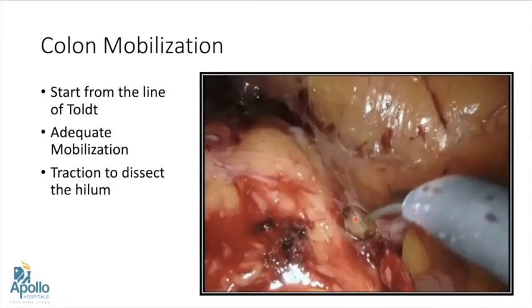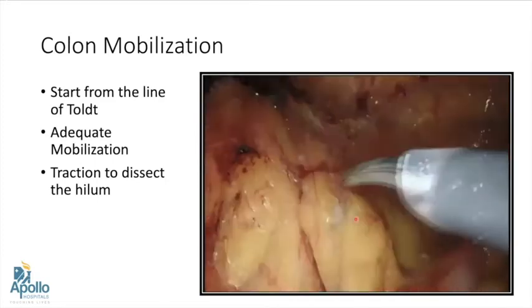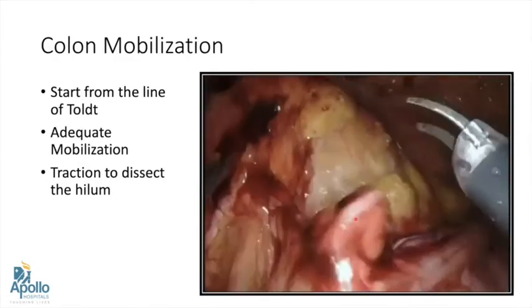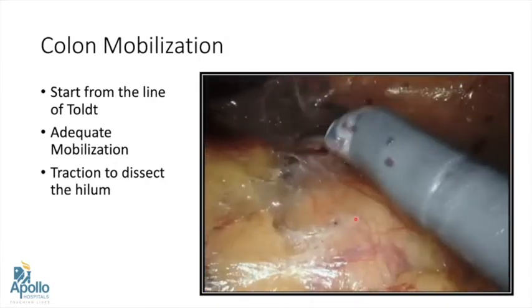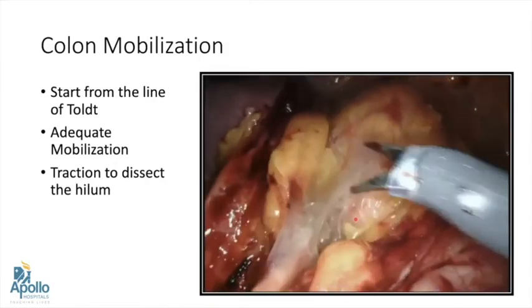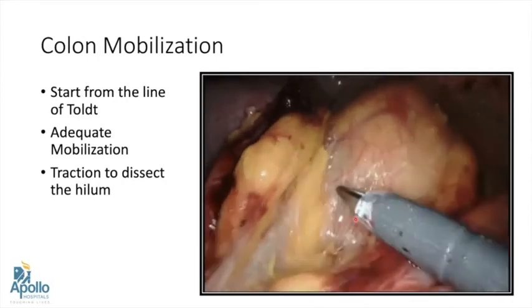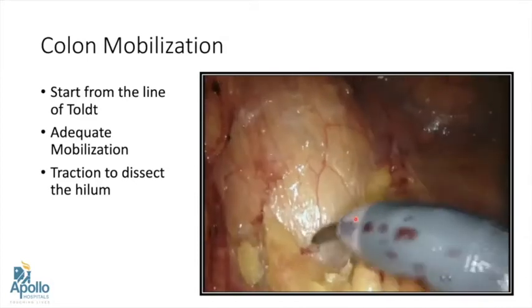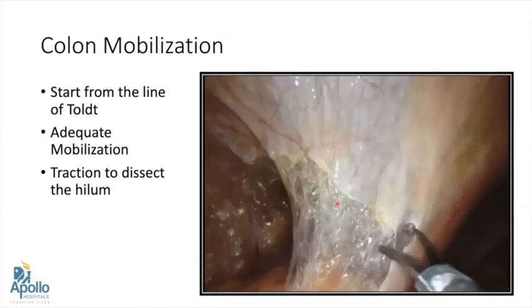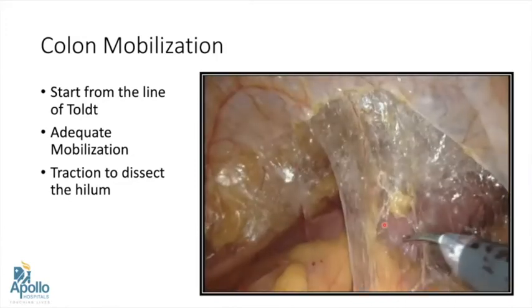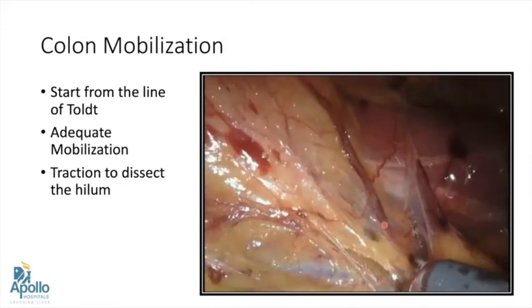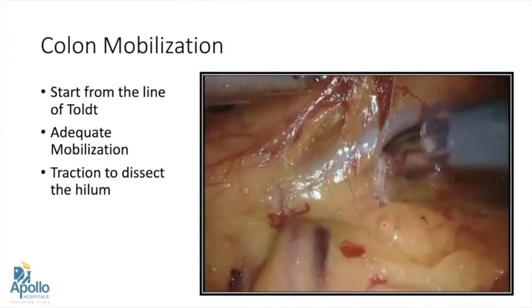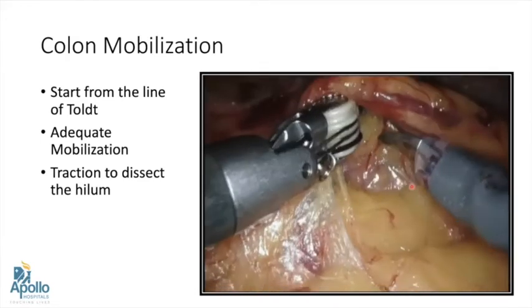The first step in partial nephrectomy is colon mobilization, starting from the line of Toldt. On the right side, mobilize from the hepatic flexure to the iliac vessels; on the left, from the spleen to the iliac vessels, so the spleen falls like an open book. Traction on the bowel opens up the plane, making dissection much easier. Lifting the lower pole fat demarcates the ureter.